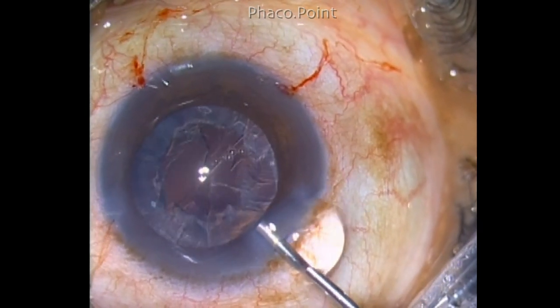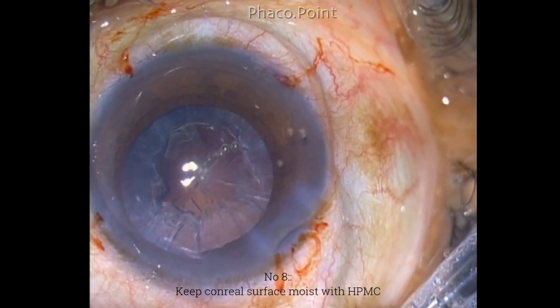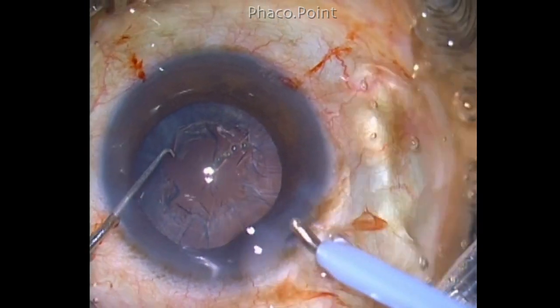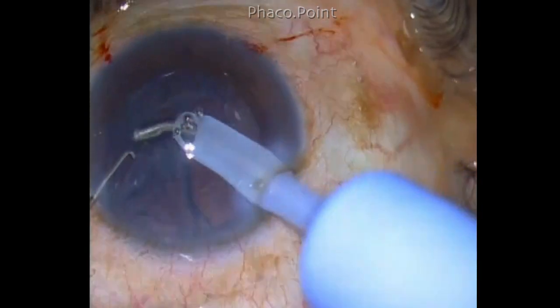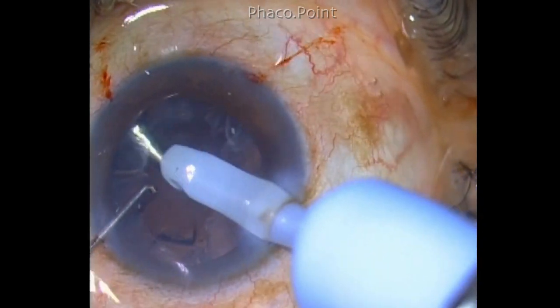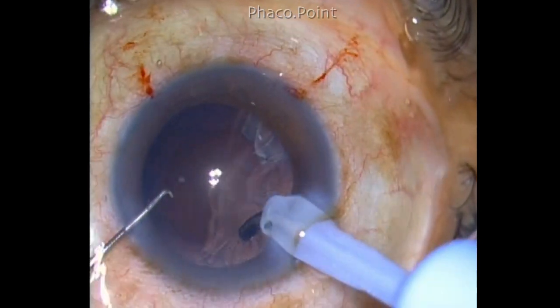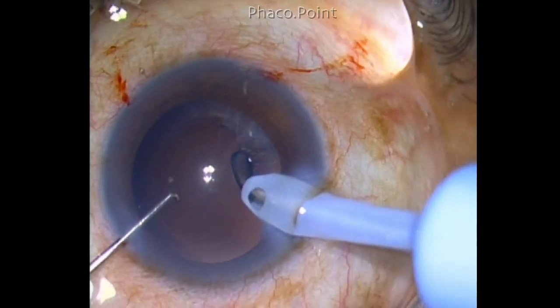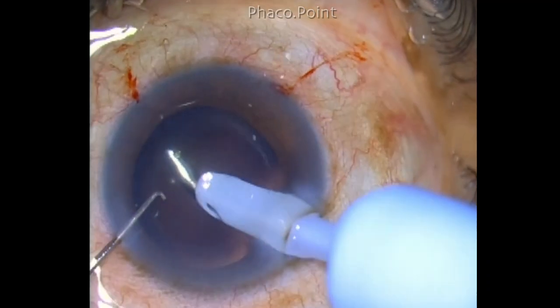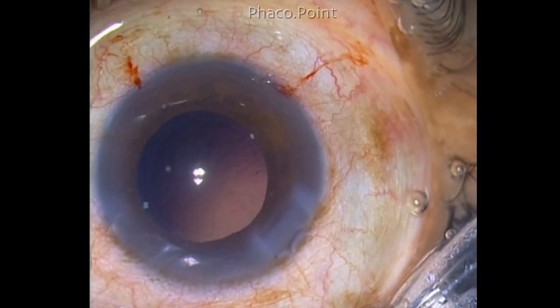Once this is done, ensure that the corneal epithelium is kept moist by coating it with HPMC. The cortical aspiration is then performed. You can use a bimanual IA or a coaxial IA — that is totally up to you, whichever you're comfortable with. The technique that you do most often is the technique you are comfortable with. In this case, I washed off all the cortical material with the coaxial IA probe, which I feel very comfortable with.